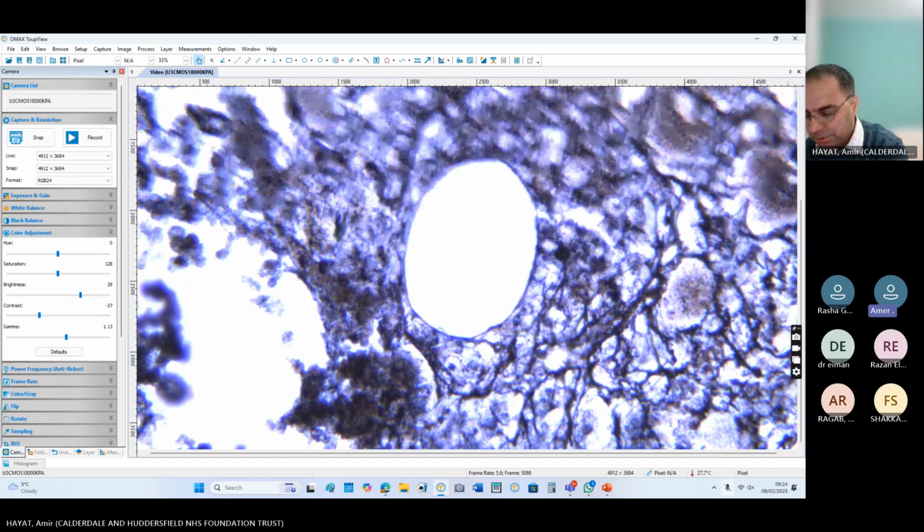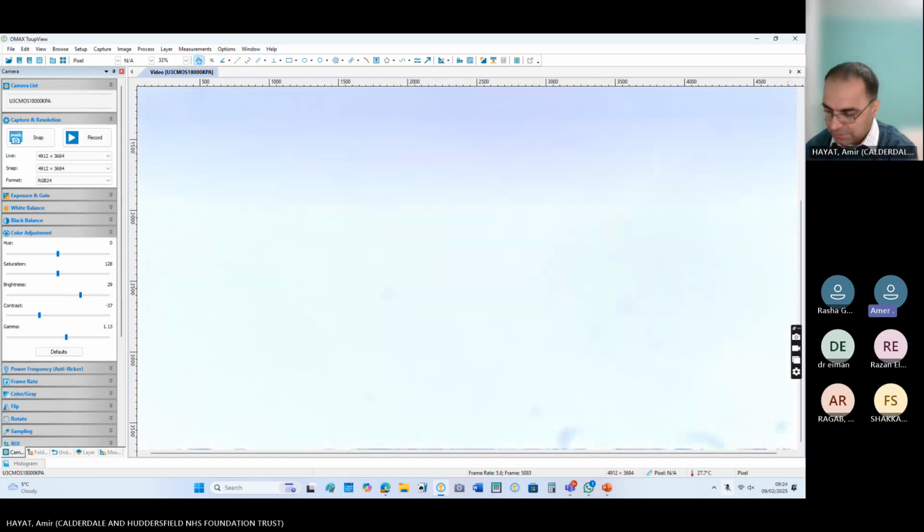So when you report the blood film for the FRCPath exam, you need to comment on the cell lines, starting from the one which has the abnormality, and then you have to give your impression, like what you are suspecting in this patient, and then you have to give your opinion as well, a suggestion of what next you would like to do in this patient.